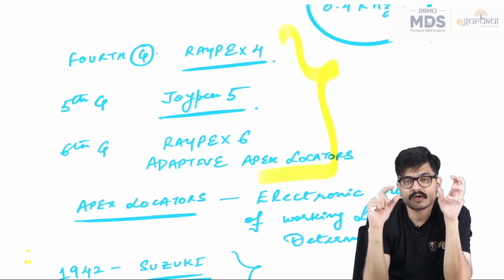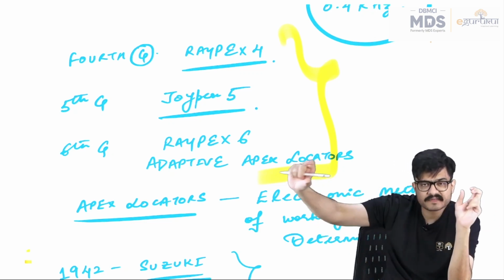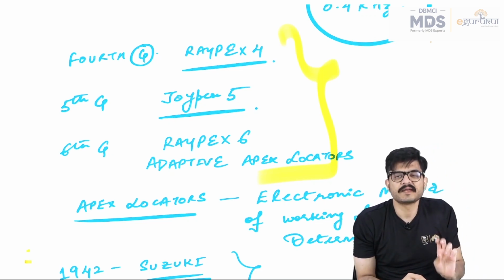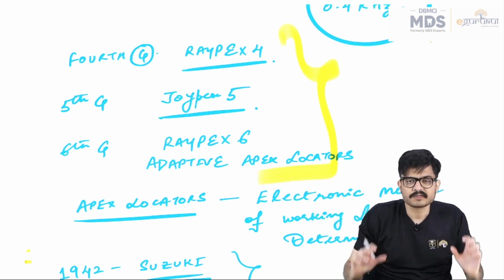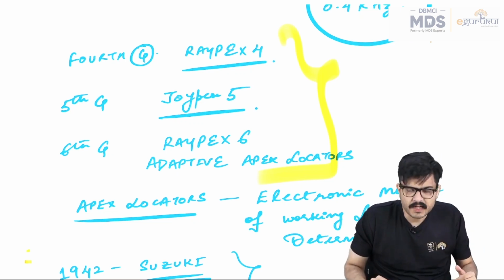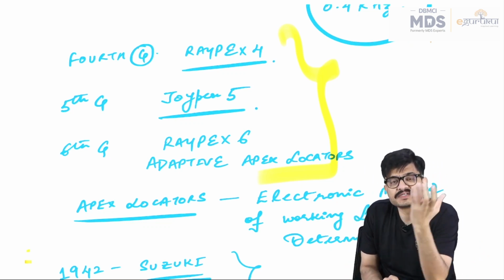And then in order to increase their accuracy, they would take a mean, like a root mean square value of all those impedance values at one particular frequency and say that this is my final impedance value for this particular frequency. Then they would use the other frequency, then the third frequency, fourth, fifth, and so on. Now, the point is that the fourth, fifth, and sixth are just, you can say, additions and modifications to the basic third generation philosophy.